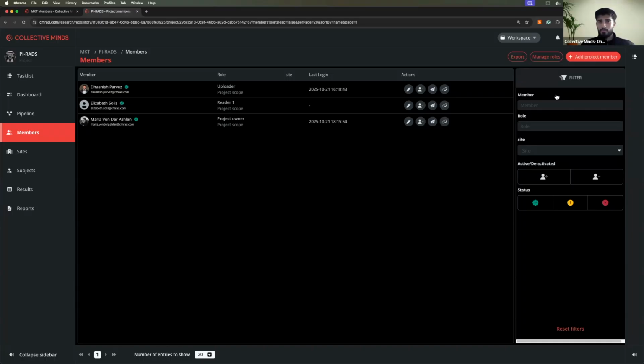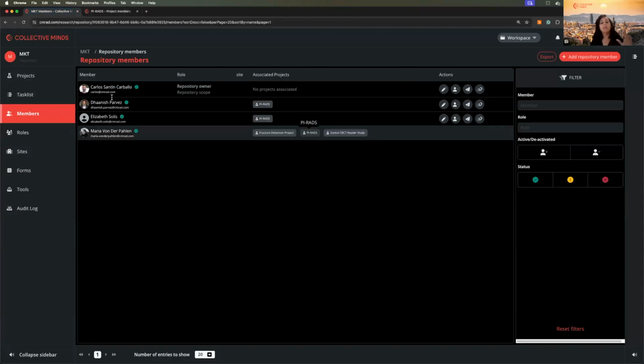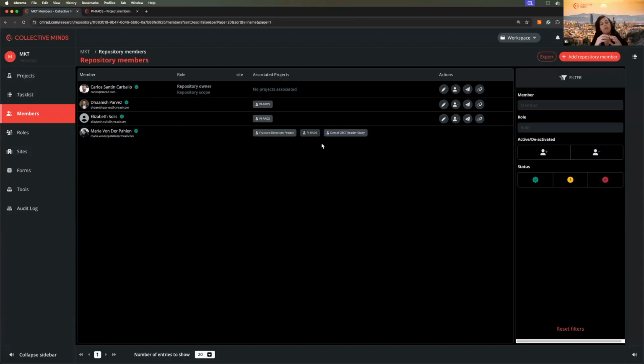Brilliant. And Ellie, is there a maximum number of projects that each member can be a part of? Not at all. They can be part of as many projects as you have in your repository. What will happen if you go to the members page and they are part of a lot of repositories is that instead of presenting all of the project names, you will see an icon with an ellipsis button, like dot dot dot. If you click on that, you will get the complete list displayed. So we still keep things looking very nice, but they can be part of as many projects as you have on your repository.